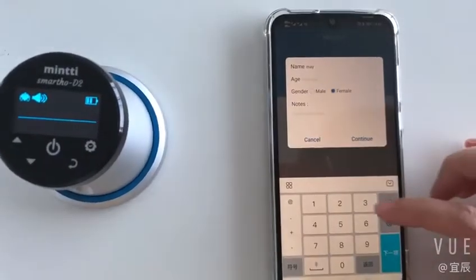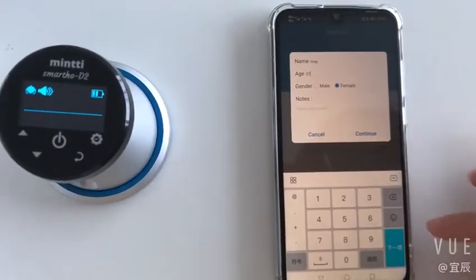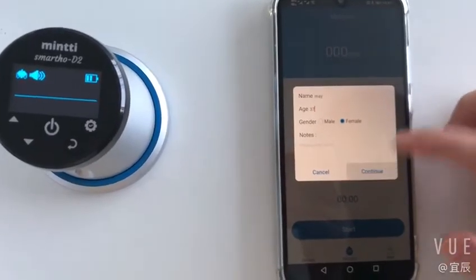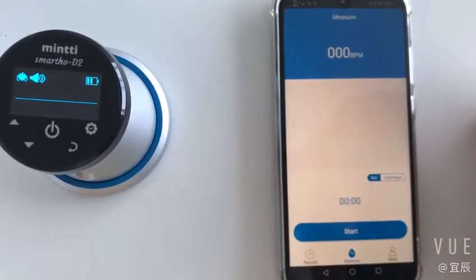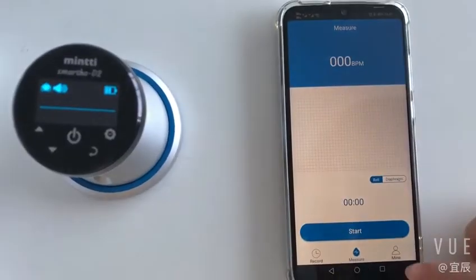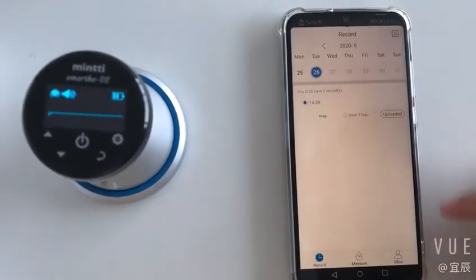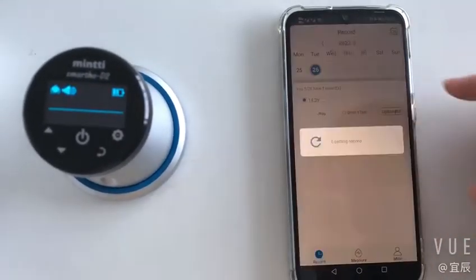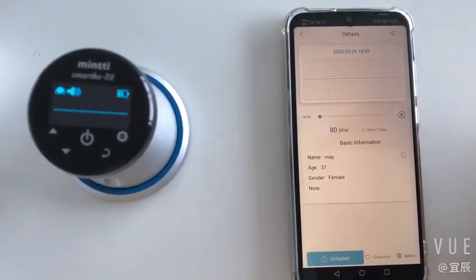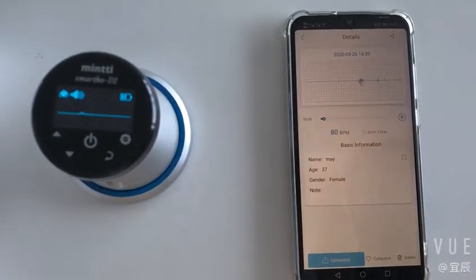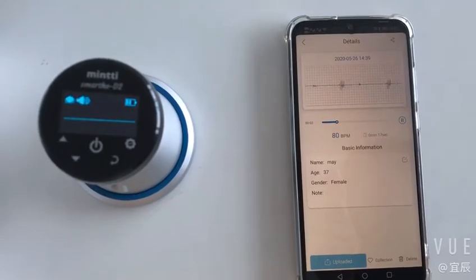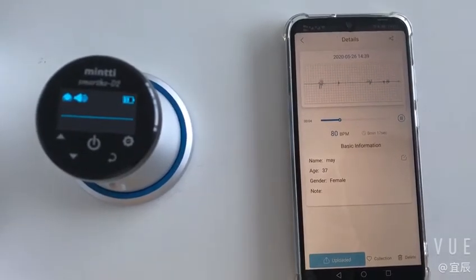After clicking the measurement button, you can start the measurement. During the measurement, you can hear the sound collected by the device and check the detection time. The waveform and heart rates will be displayed on the software in real time.